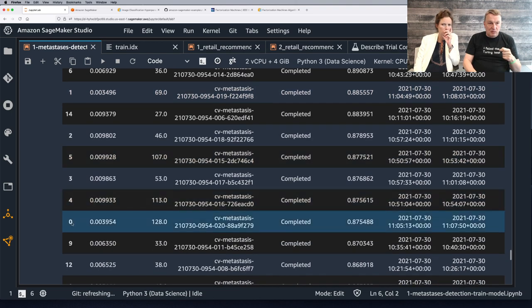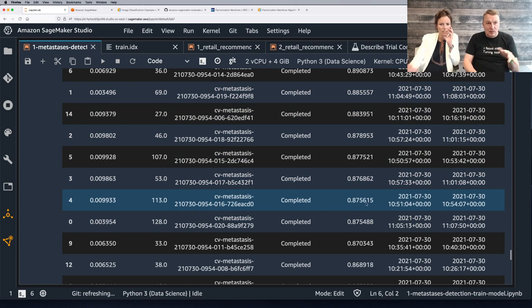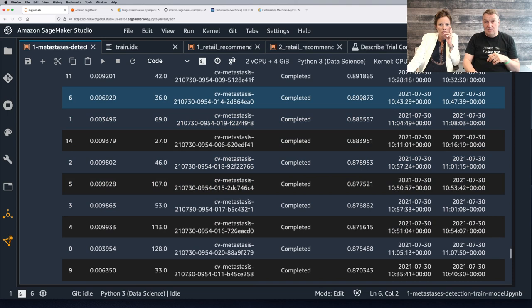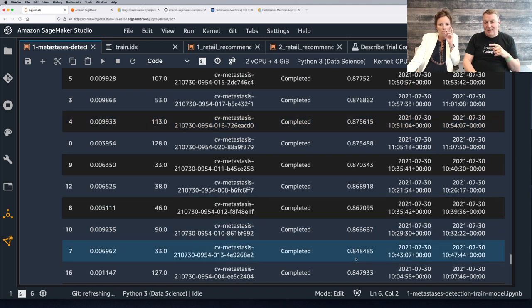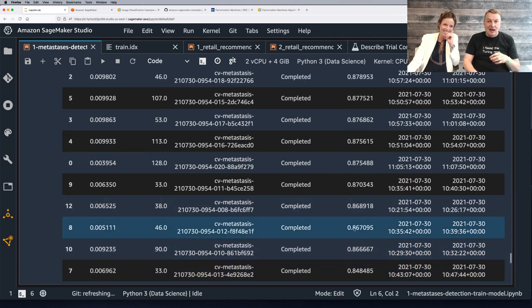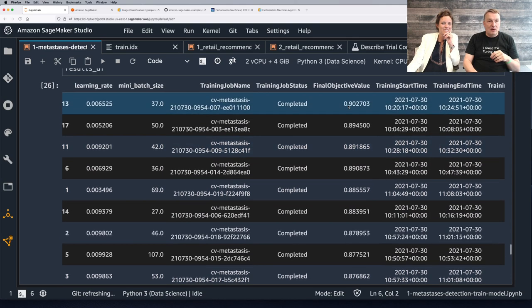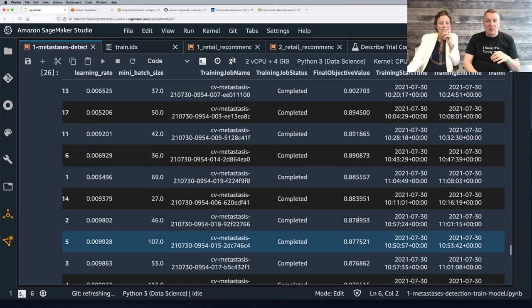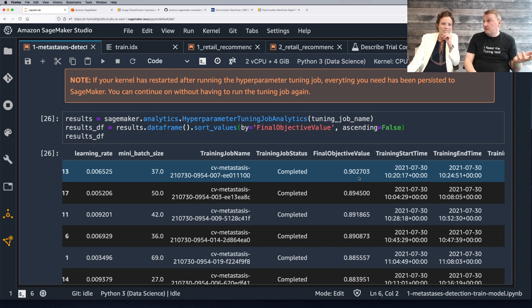We can see the top job reached about 90% validation accuracy, which is a very good starting point. And we can see it was job 13 — the 14th job. So it took a little while to converge. Job 0 was 87%, job 1 was 88%, job 2 was close to 88%, job 3 was 87% — that's the exploration phase. Step by step, it's not a linear process: we explore and take bets on parameter values, but we got to 90-plus percent. If we trained more and explored more hyperparameters, we could certainly do better.